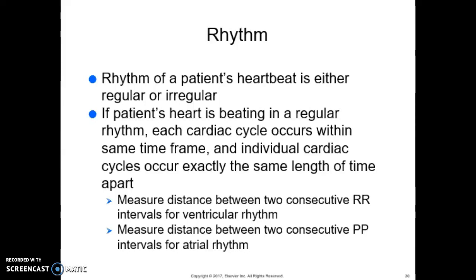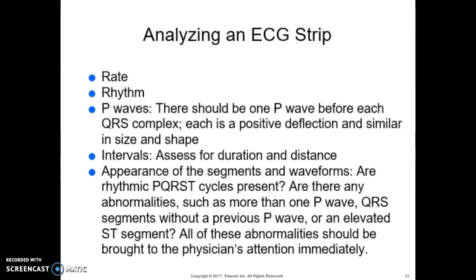So welcome back for part 3. I was asking you this question, again regarding the information that we just went over on the side. How does measuring these distances determine the heart's rhythm? If the heart's rhythm is regular, each of these interval measurements is the same. Okay, so it's important to remember that.